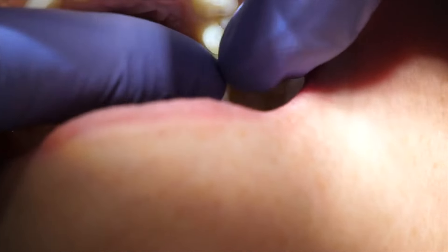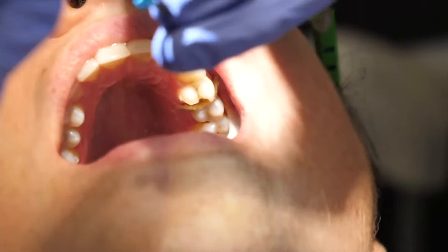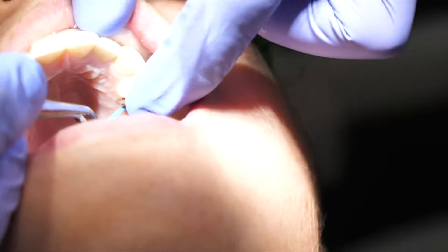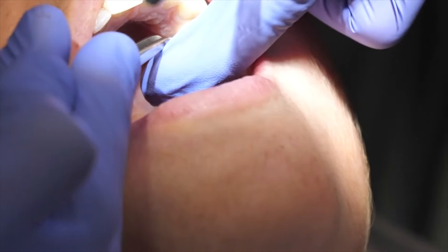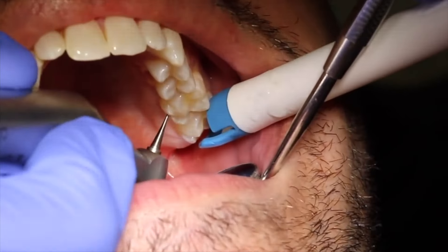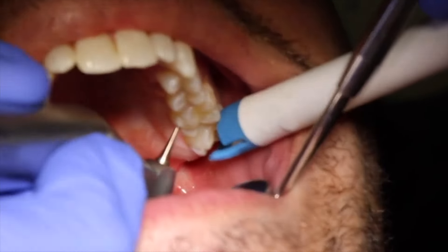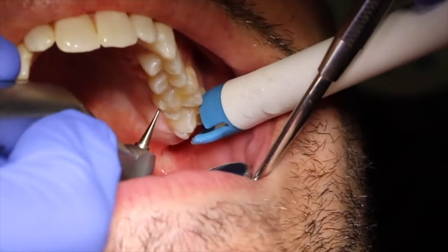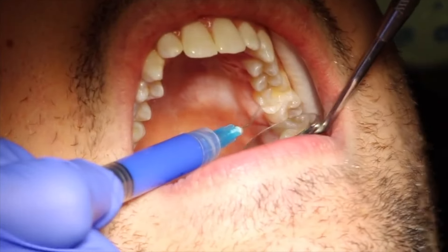If the cavity is between the teeth, they will place a band around the tooth and a wedge sometimes, so the filling material does not pour over onto the adjacent tooth. It separates the two teeth away from each other. They may also use a clamp to hold it on. But if it's a one-surface cavity not touching the neighboring teeth, they won't need the bands, wedges, or clamps, and will just move on to the next part, which is the etch.